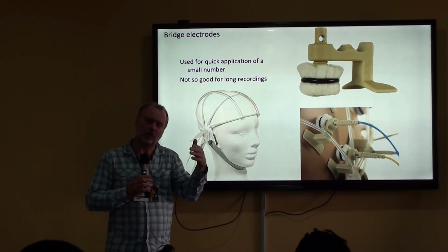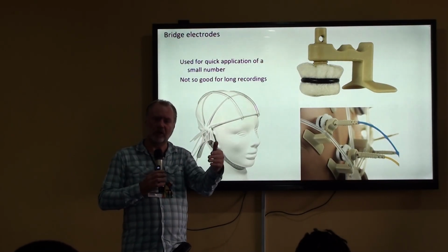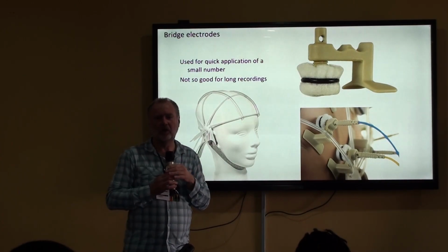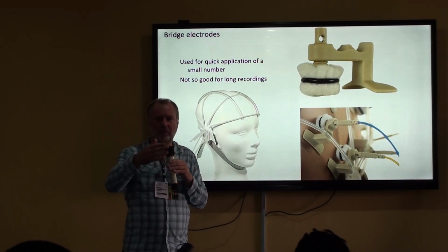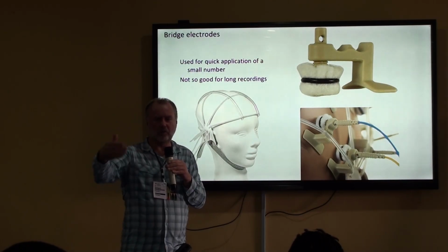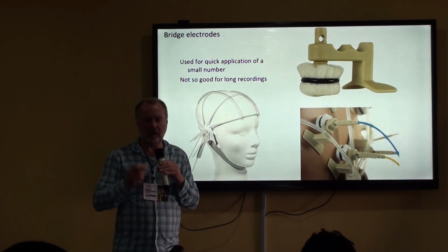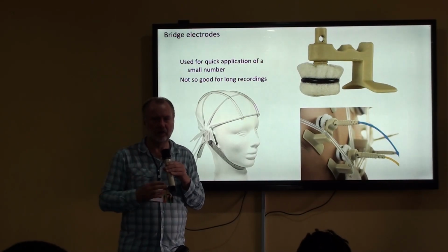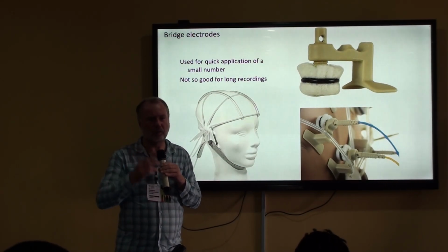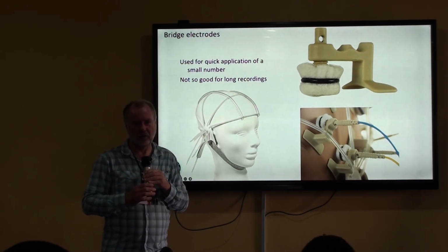For remote monitoring, I think it would also be better to do the recording while the neurologist is looking along. But if the recording then subsequently gets disrupted because of Wi-Fi or mobile connection issues, you would still download the whole recording afterwards and then review it properly by going back and forth in the data. That's what a neurologist would do anyway. So I think you need a combination, but it's also about the procedures. It's not only about the EEG system.